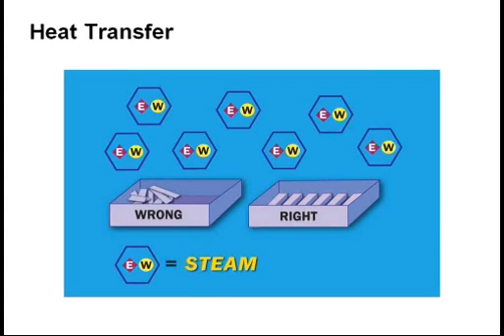This picture describes heat transfer and represents energy and water that has become steam, thus entering the chamber. The tray on the left has instruments piled in one corner of the tray. The tray of instruments on the right are evenly distributed. This arrangement is key to better steam contact to all surfaces with a higher probability of drying.